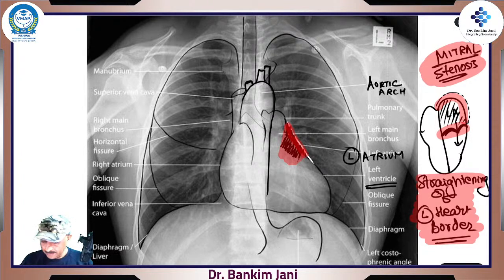Okay. Then watch for this, yeah. Diaphragm. No need to explain, right? This one is the left dome of the diaphragm and this one is the right dome of the diaphragm, which you can see very easily. This portion, right? Now, because you have seen dissection, you'll be able to appreciate very cleanly that this thing is the inferior vena cava, right? Inferior vena cava. So this is the angle between the diaphragm and the heart, right? Acha.